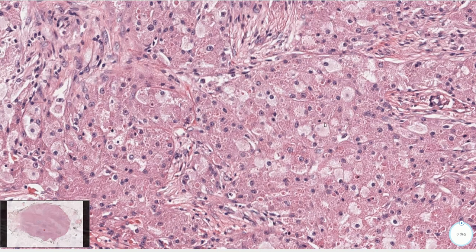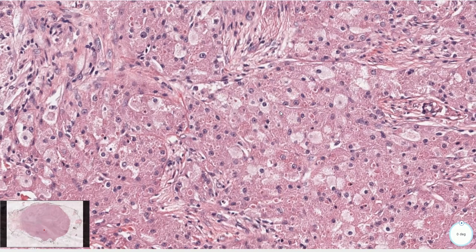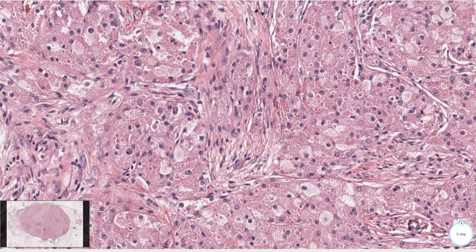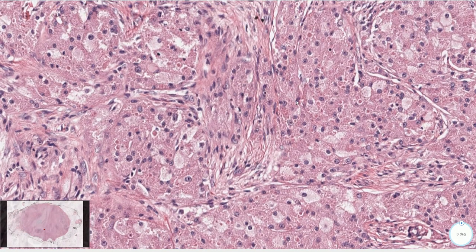These cells are immunohistochemically positive for S100 and negative for cytokeratin, and they are thought to arise from Schwann cells. These cells have a neurogenic origin and therefore we see S100 positivity.